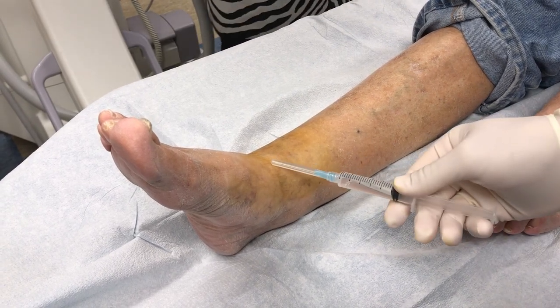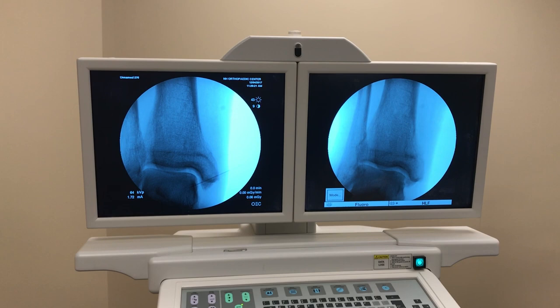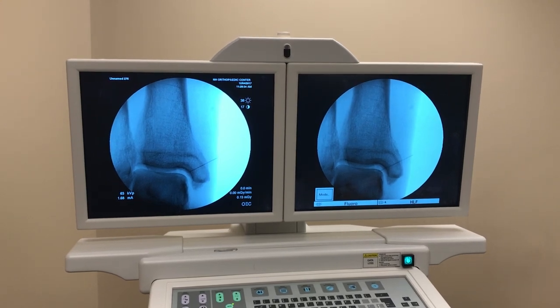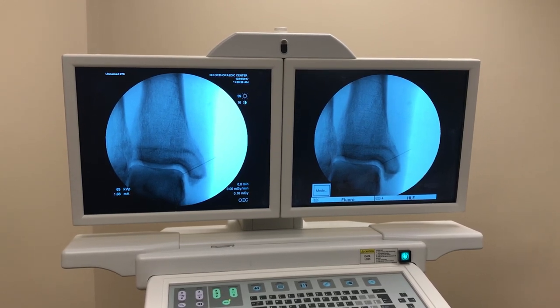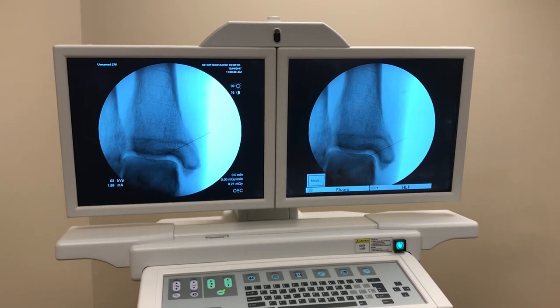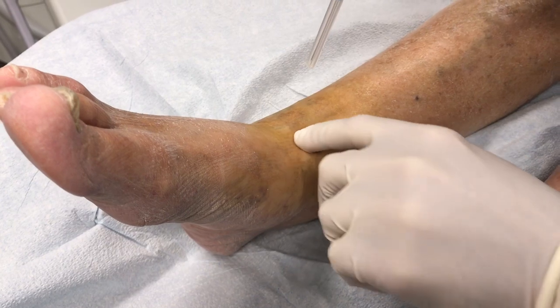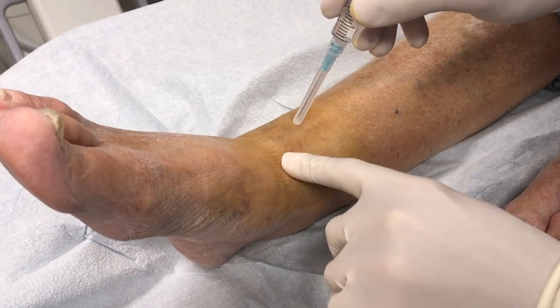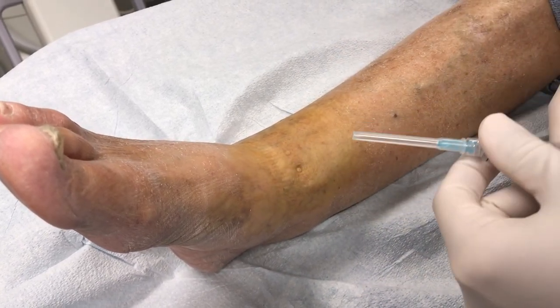We'll take an X-ray to get our positioning. I have to move up, or proximal, a bit. I'll move over just a bit, then over, and then up a little bit. I'm going to make a little mark on the skin right at the soft spot, then move over just medial to the anterior tib and make a mark there. I'll double check my positioning.